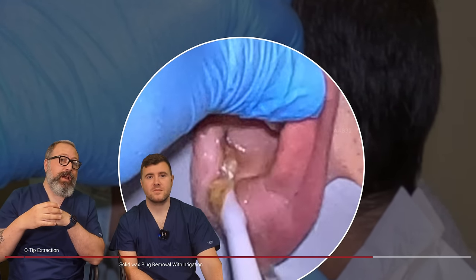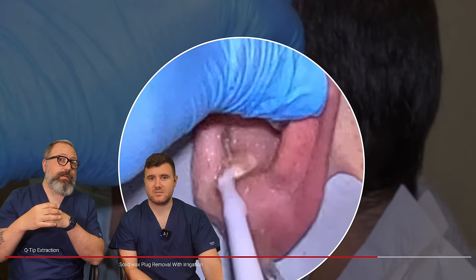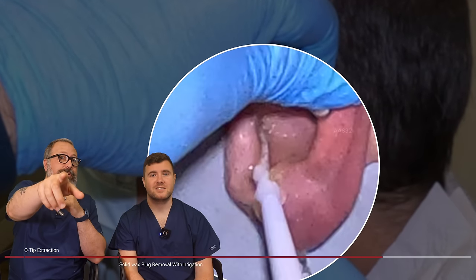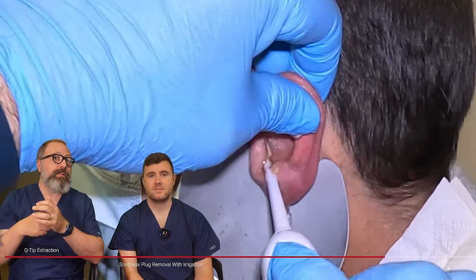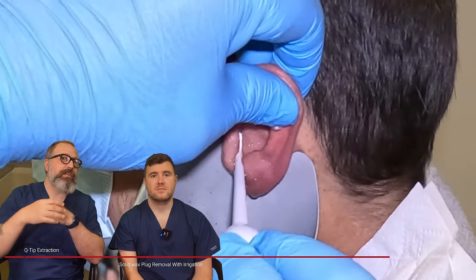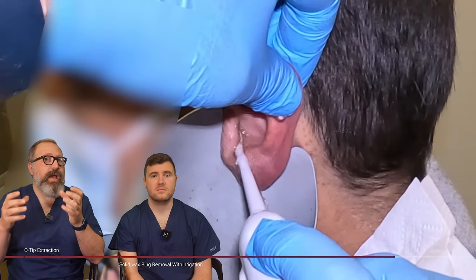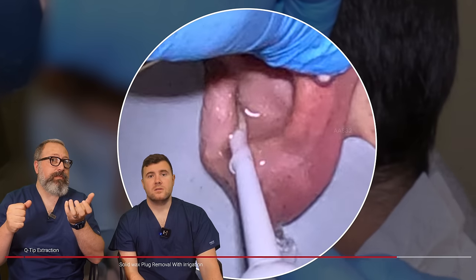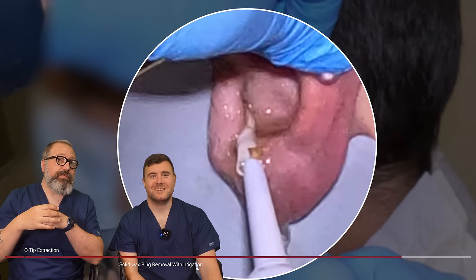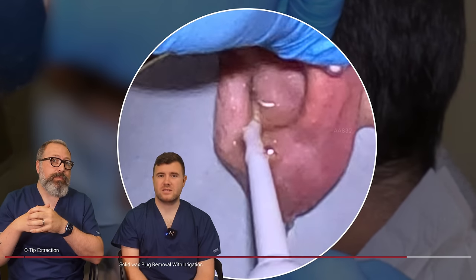Look at the size of those plugs coming out there — they are real, real chunky plugs. There are these little looser bits as well, and another piece of skin coming away. Look at the size of that piece of skin — this was all covering the eardrum, really deep in the canal. It's surprising how quick it is. We've said this since starting the irrigation — it's surprising how quick. To micro-suction that out personally I would have said that was probably going to take about 5-10 minutes. It looked very, very wet and almost kind of sticky in a way.